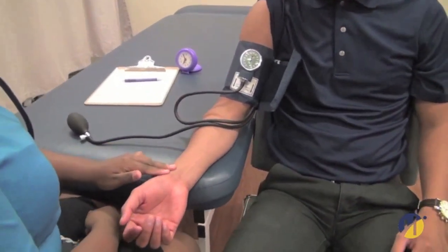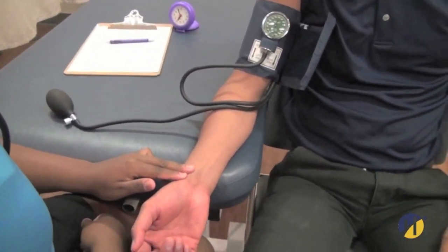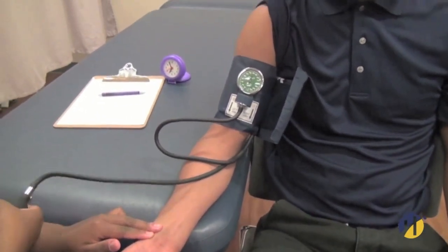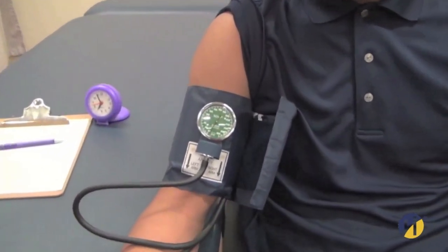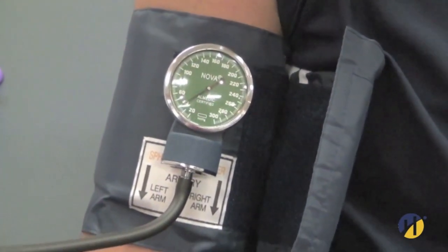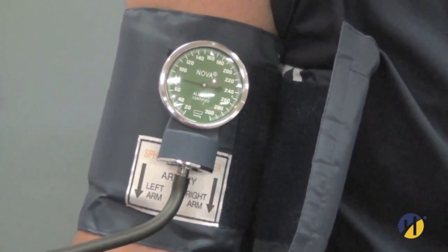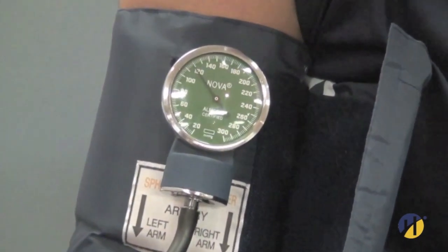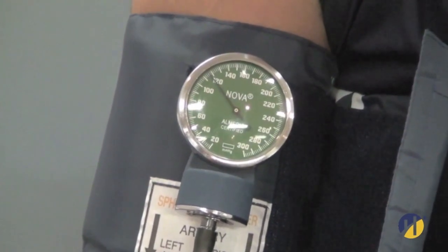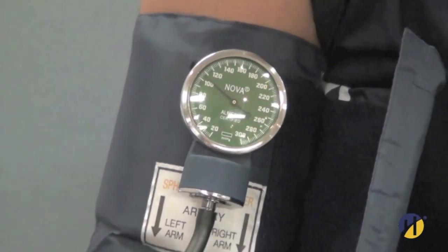Palpate the radial pulse. Inflate the cuff quickly to determine at which number the radial pulse is extinguished. In this case, the radial pulse disappeared at 120 mmHg. Deflate the cuff rapidly.